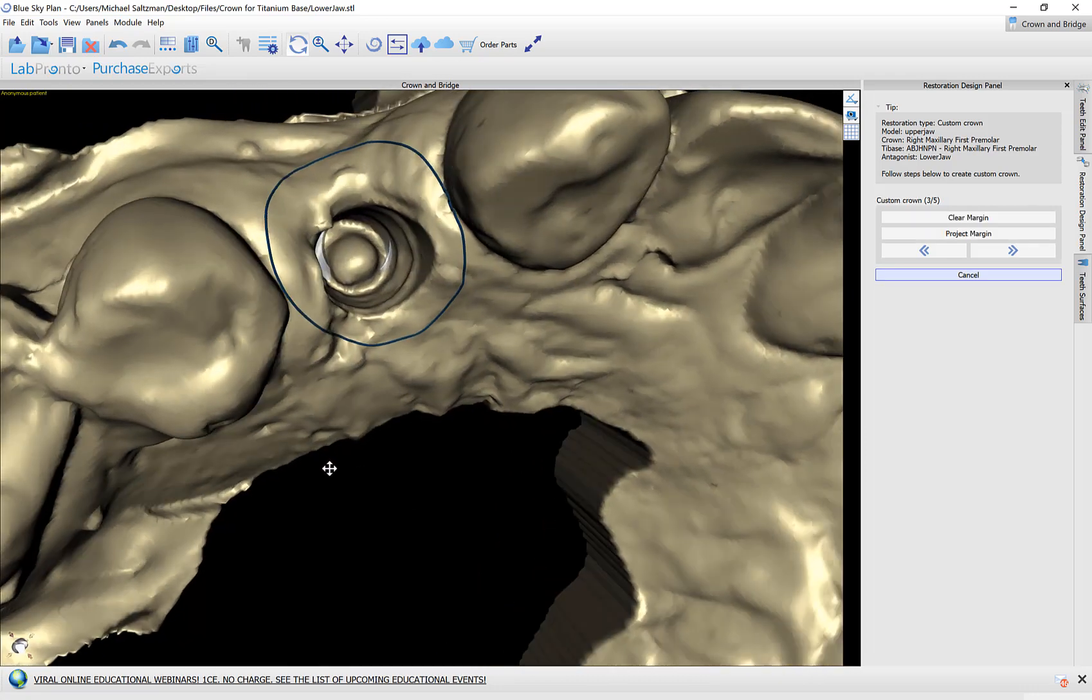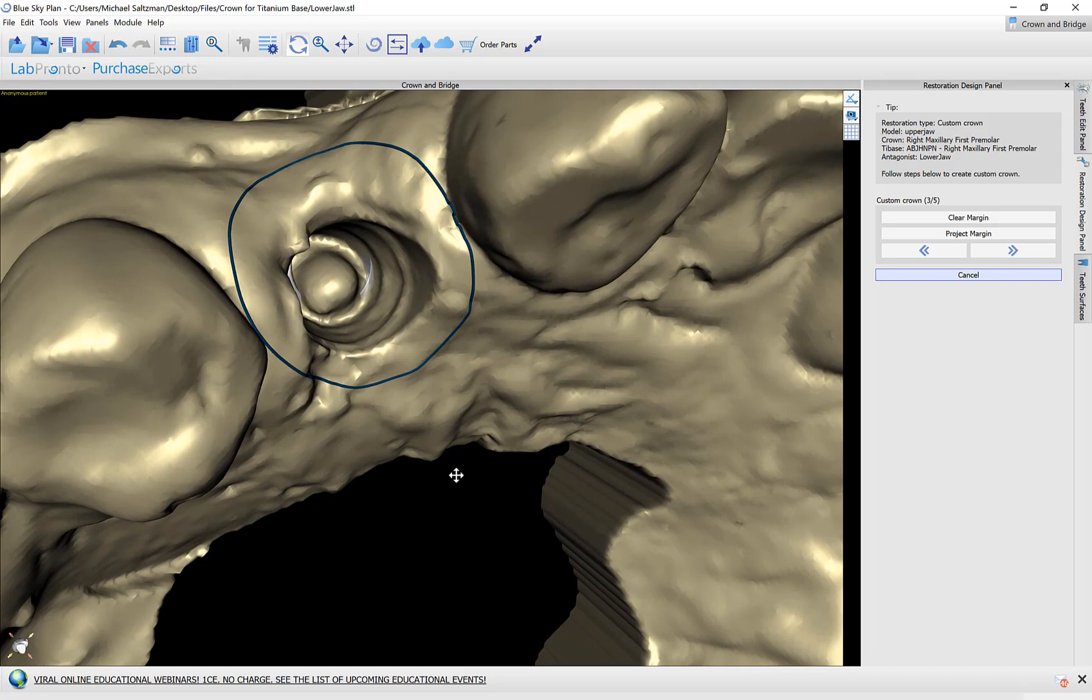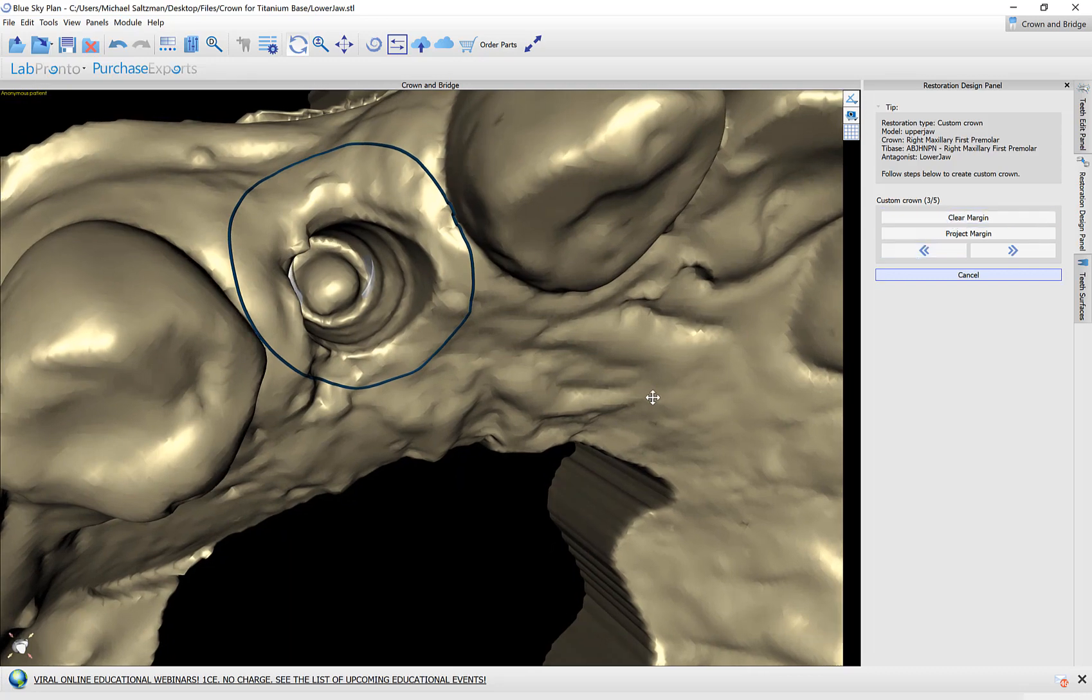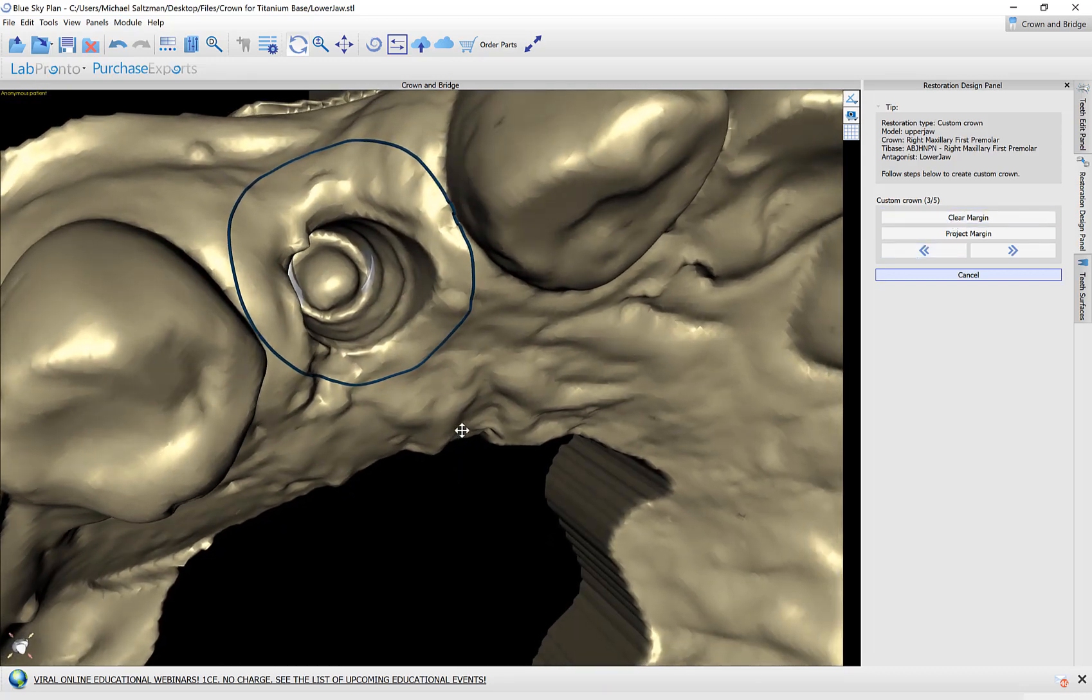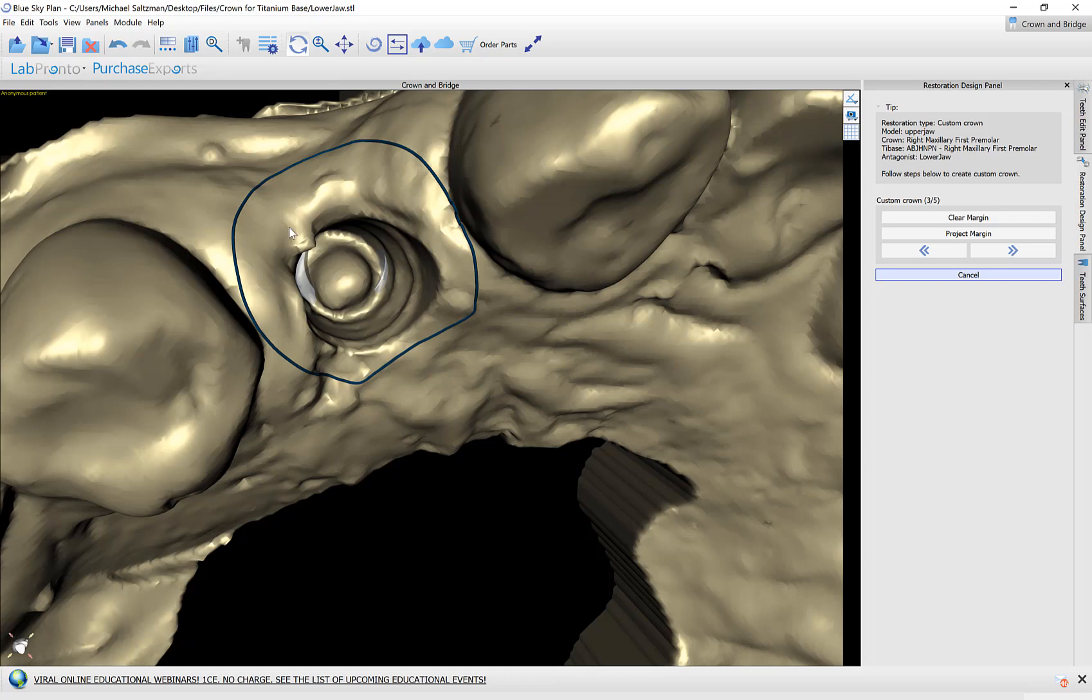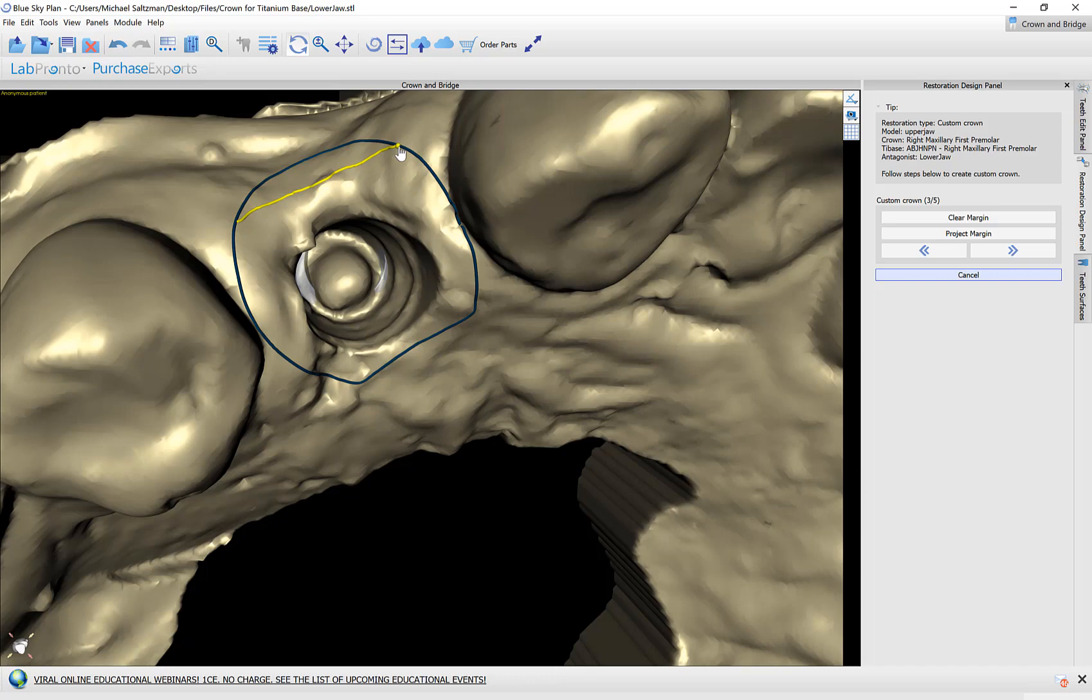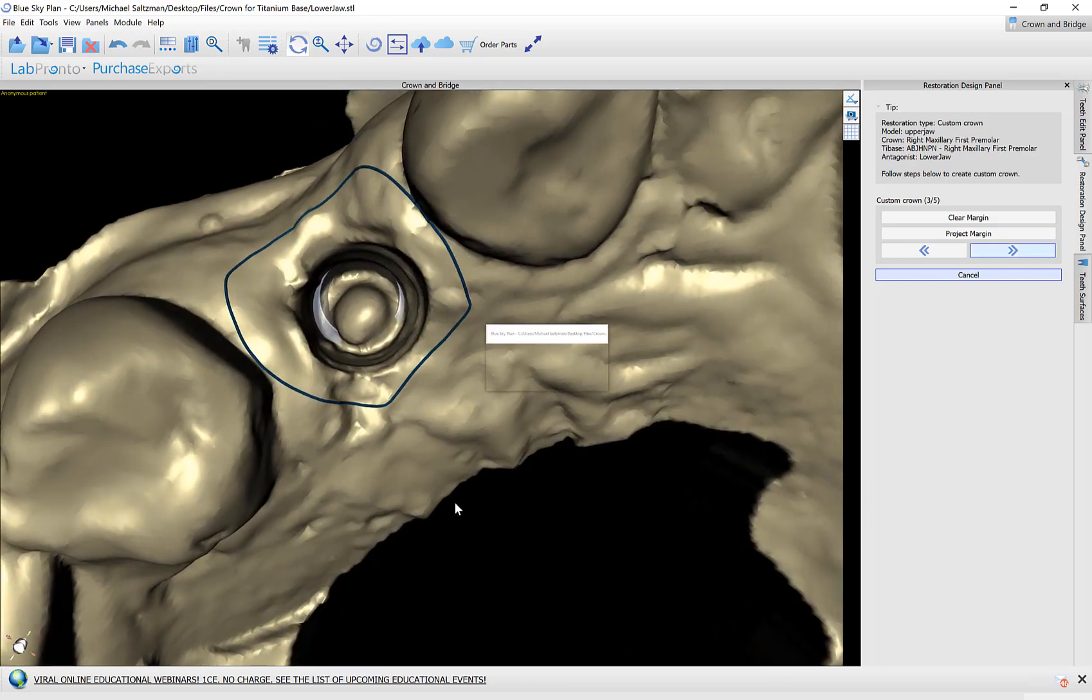The next step is to mark the margin. The software proposes the margin. I could clear the margin and redraw it by holding down the shift key and placing dots to position the margin. Or I could use the proposal the software gave. If I like to edit it, hold down the shift key and use your left mouse button just to grab and drag and to redraw and to modify the portion of the curve. Okay then I'll go ahead and click on next.